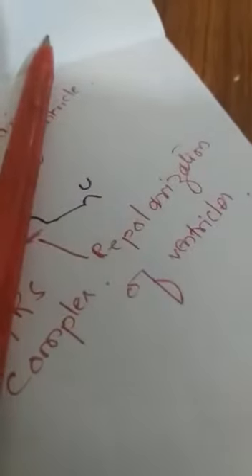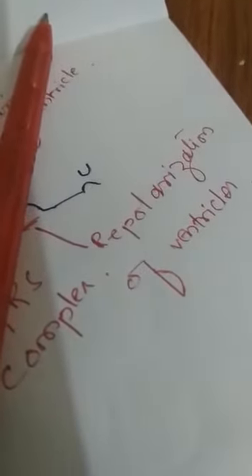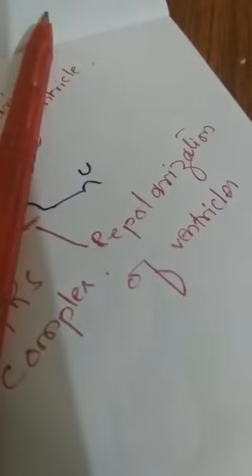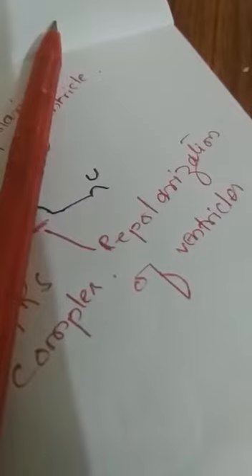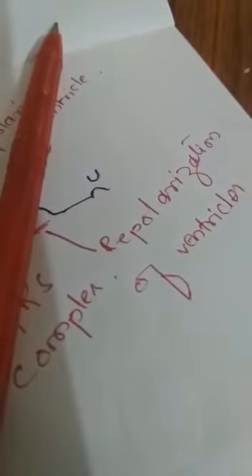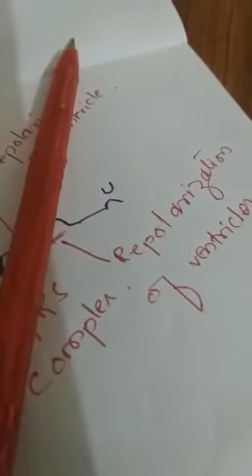The U wave is rare and often not detected on ECG paper. Now I am going to discuss the different pathological conditions and different time periods.